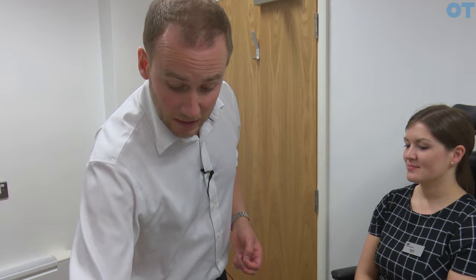As this is a contact technique we need to make sure we've anaesthetized the cornea. To do that we're going to use Proximetacaine, taken from the refrigerator. Before we use any topical drug we need to make sure that we've met some criteria — the mnemonic we can use is the 4Ds: drug, dose, date and disposal. Once we've achieved all those, we can use the drug.